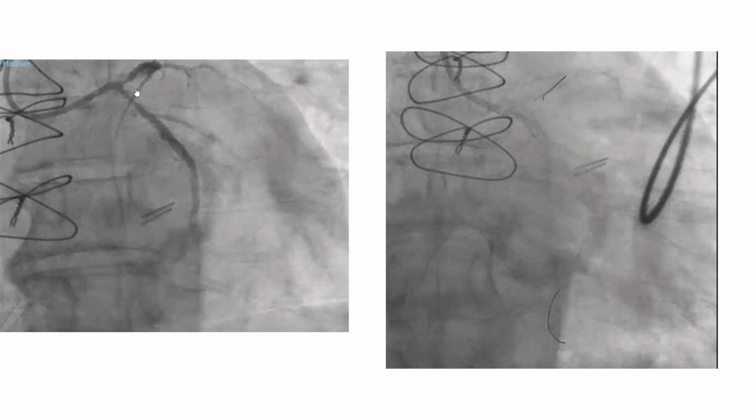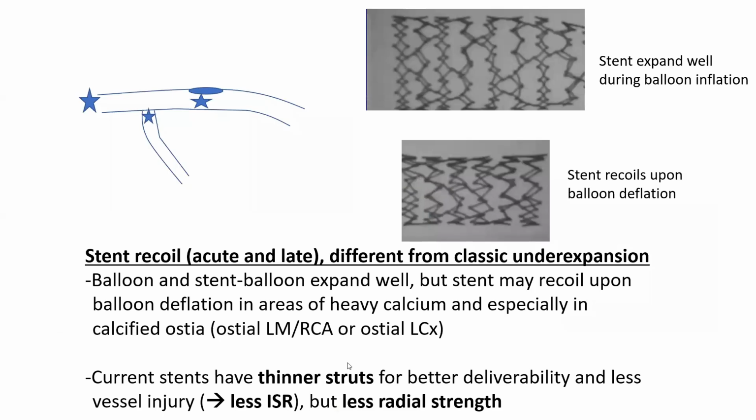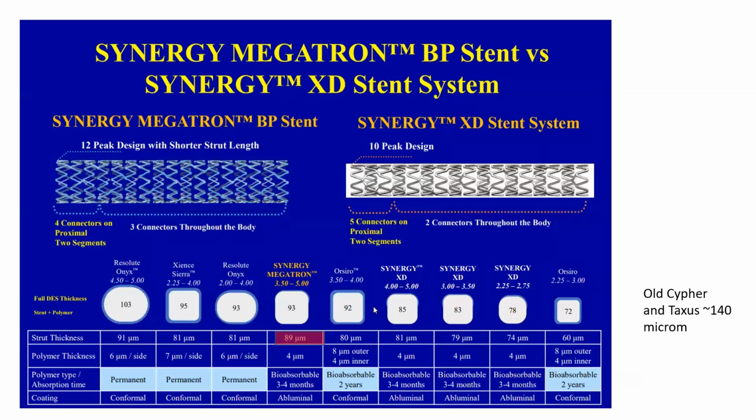It's the fact that I noticed that each time I expand the stent, it will tend to collapse again. So there was some stent recoil. Those are cases where I may, off-label, lack of data, put a stent with better radial strength. Hopefully, we will have more data on this within the next couple of years so we can get better guidance on how to treat it.